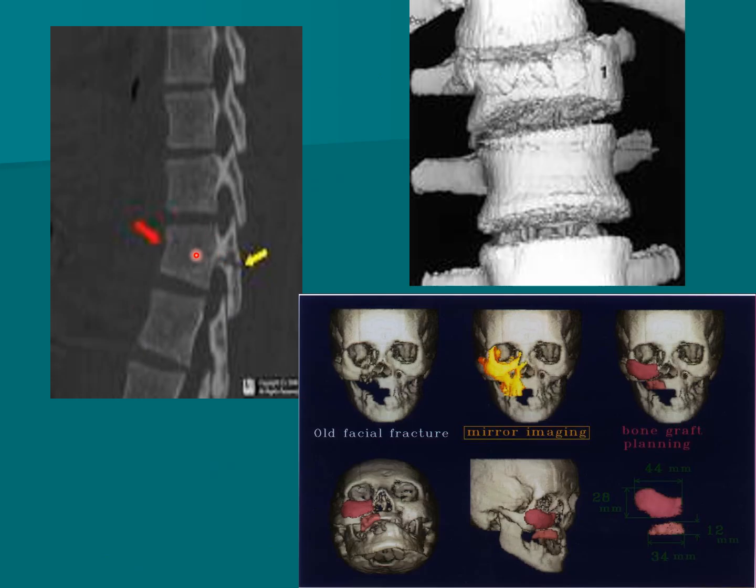And this is just looking at, here's some more fractures. This is some 3D reconstructions to show what's wrong, and then you can do surgery planning on seeing how you would reconstruct that.